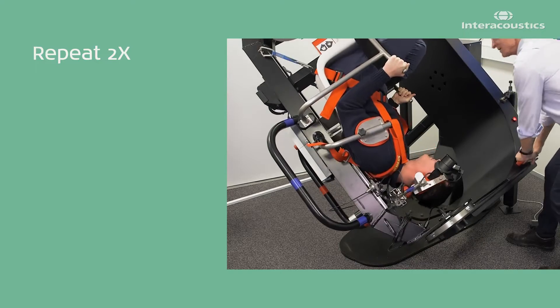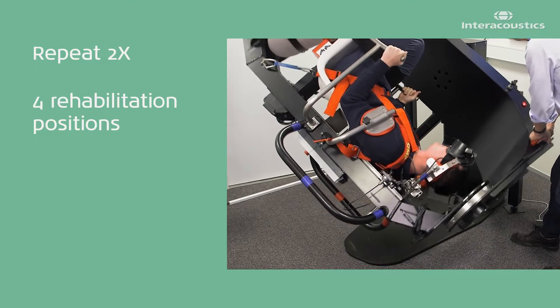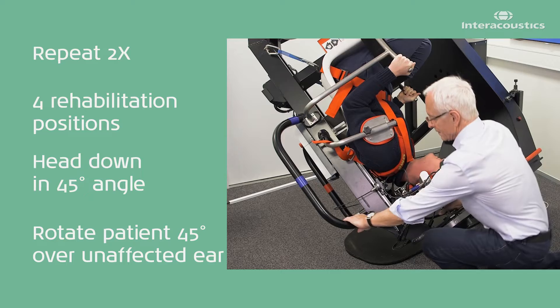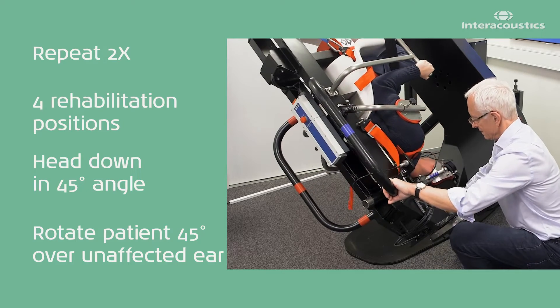Repeat this sequence two more times for a total of four rehabilitation positions with the head downwards, each time turning the patient 45 degrees over the unaffected ear.